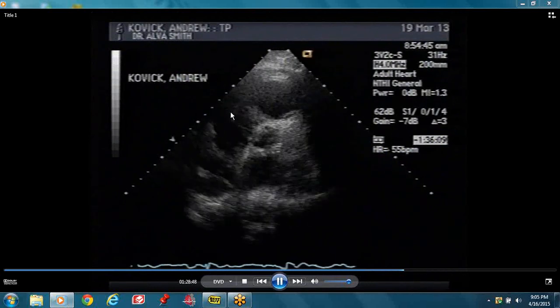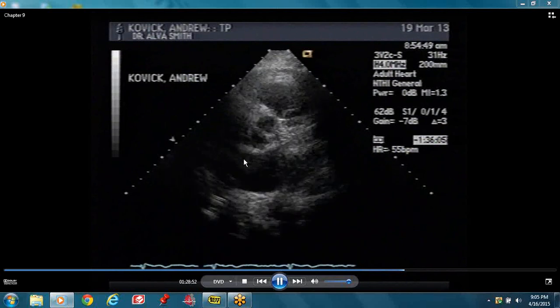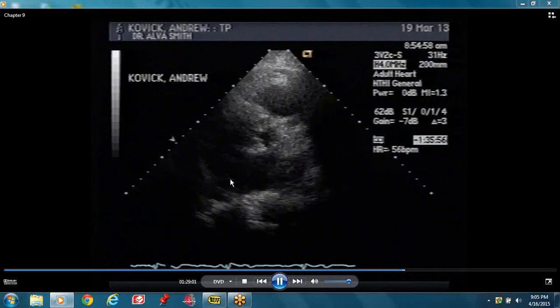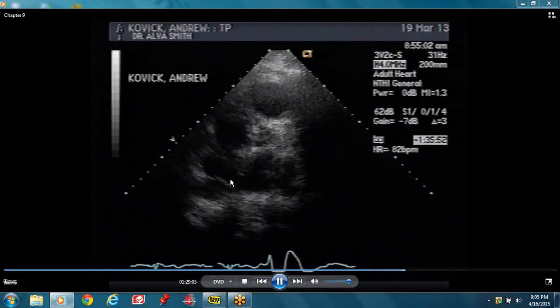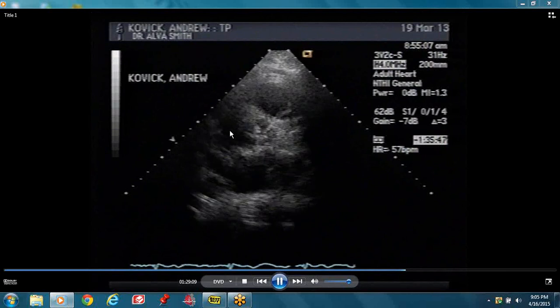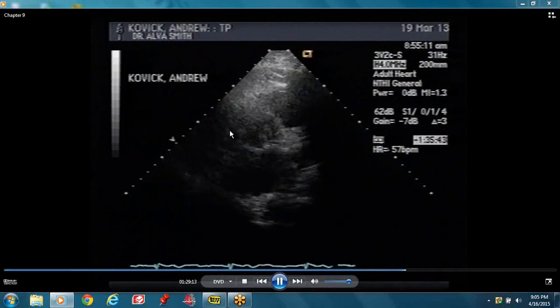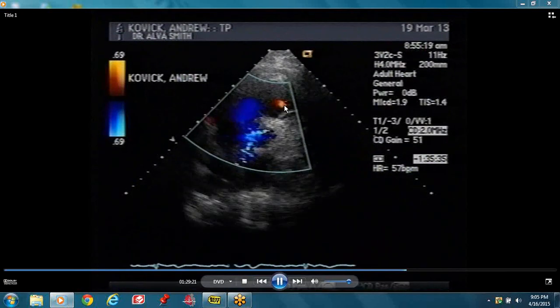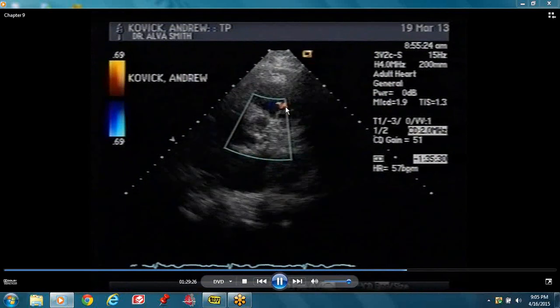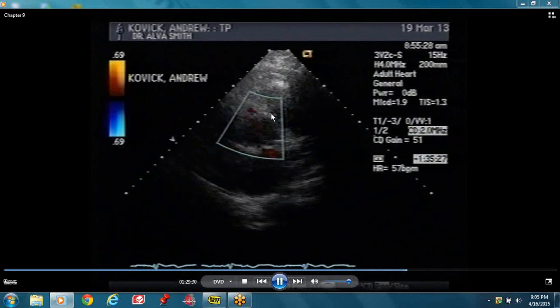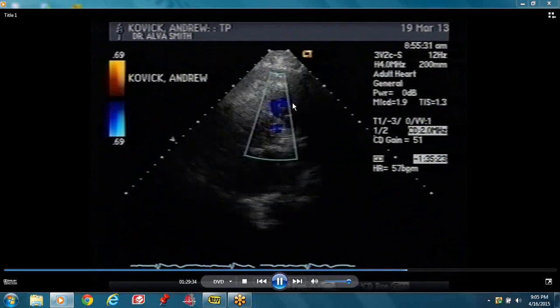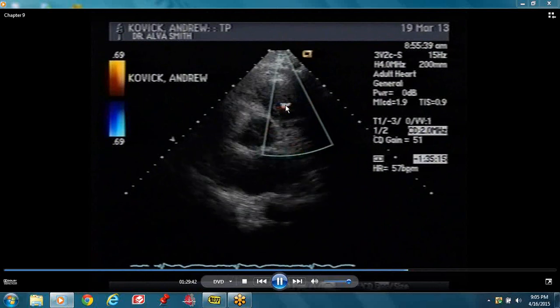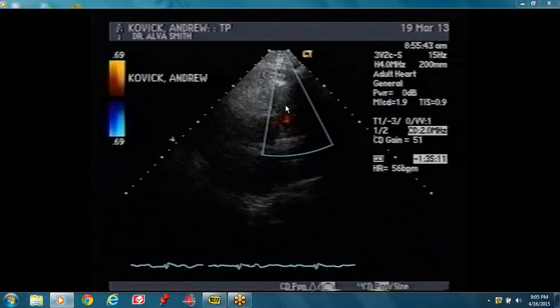Your pulmonary valve is over there, opening and closing. Tricuspid valve is expected somewhere inside there. The important thing is that the aortic valve is thickened and somewhat restricted. The color flow is across the pulmonary valve — you see color going up there. That's the PI — pulmonary insufficiency. When you go with your pulse wave Doppler, you can fully assess the pulmonary insufficiency.